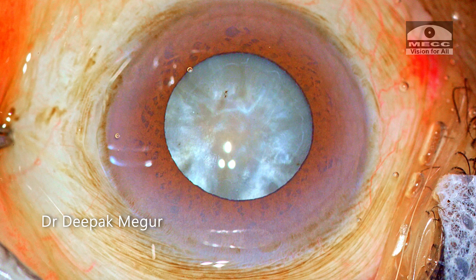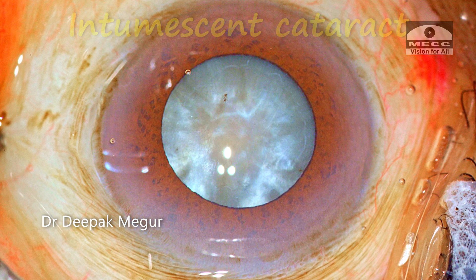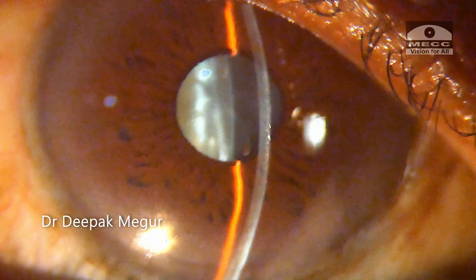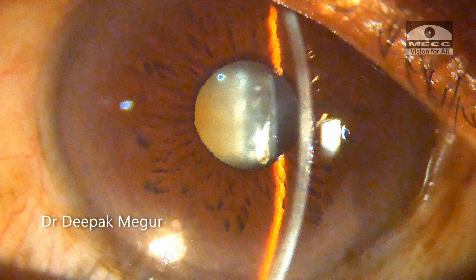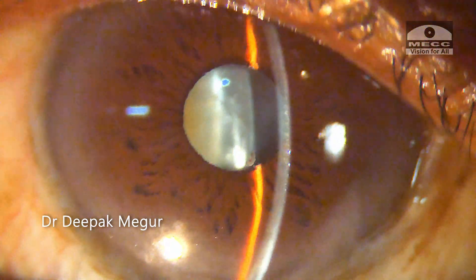Hi friends, this is Dr. Deepak Meghur, and I am here with yet another case of an intumescent cataract in an elderly patient. The anterior chamber is extremely shallow and the patient has pseudo-exfoliation as well. The pressures were all right at this point, and we did not dilate the patient even during biometry, fearing the risk of the patient developing pupillary block angle-closure glaucoma.